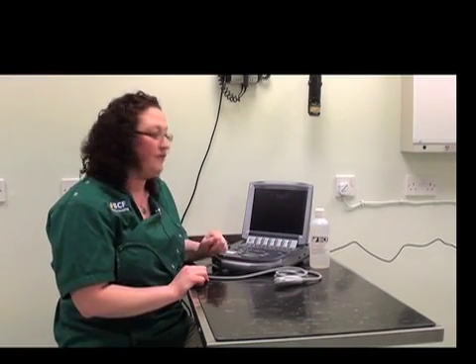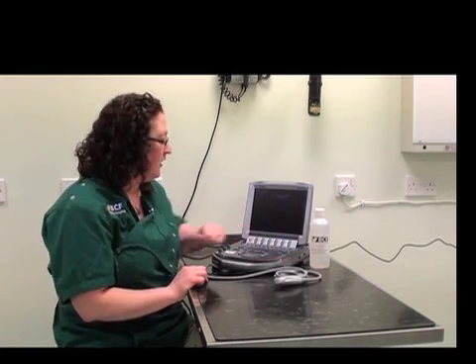There are two main components to the ultrasound machine. The first is the machine itself and the second is the probe. We'll start off by going through some of the buttons on the machine.